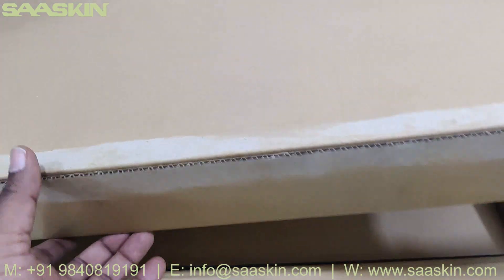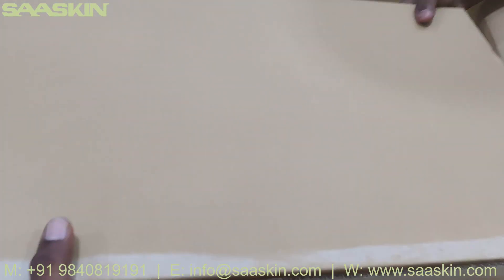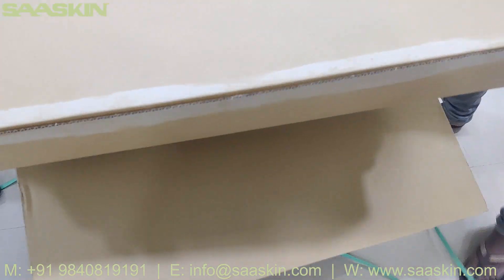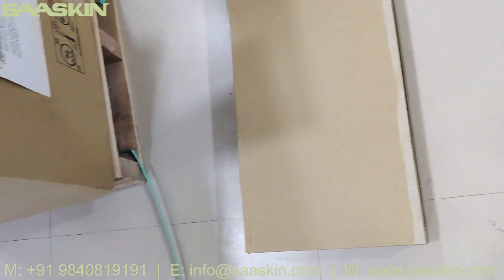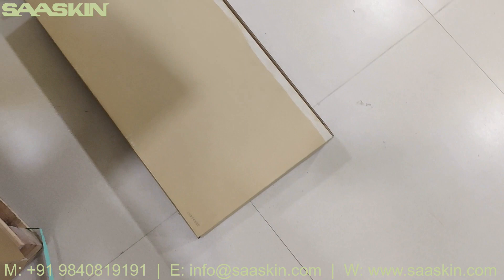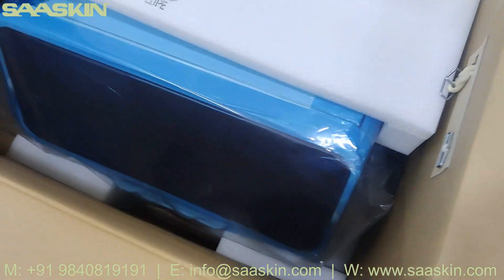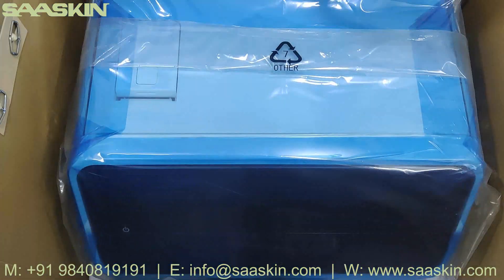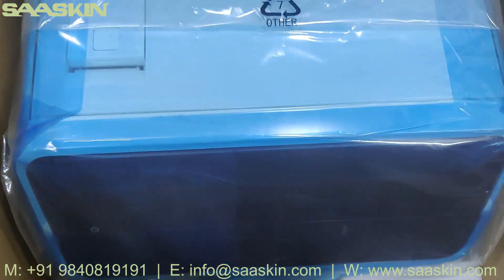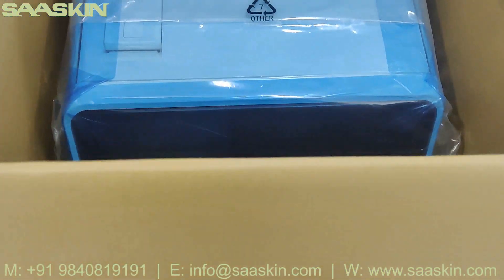Here we go. Just taking the help of my team to remove this. That's one box — just keeping this here. There are some more additional boxes. It's well packed. You can see the machine here — there is one box that comes this way and the machine is here. I am going to move the machine out of this box.